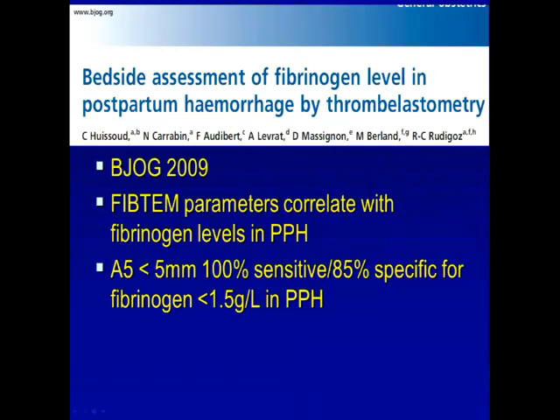But you'll get as much or more information with ROTEM than you would with a panel, wouldn't you? Well, INR has a range, right? We don't have that range for ROTEM. Yeah, so what it would end up being is, for the EXTEM, the extrinsic pathway, you would look at quantifying something like the clotting time, and then there would have to be a new range. But I don't see us going that way right now because of cost and the fact that INR is validated for that reason. Actually, it's only validated for warfarin monitoring. And I think NOACs are going to advance so much that in a little while, maybe not our practice, but maybe your practice, warfarin will be something you discuss like curare.